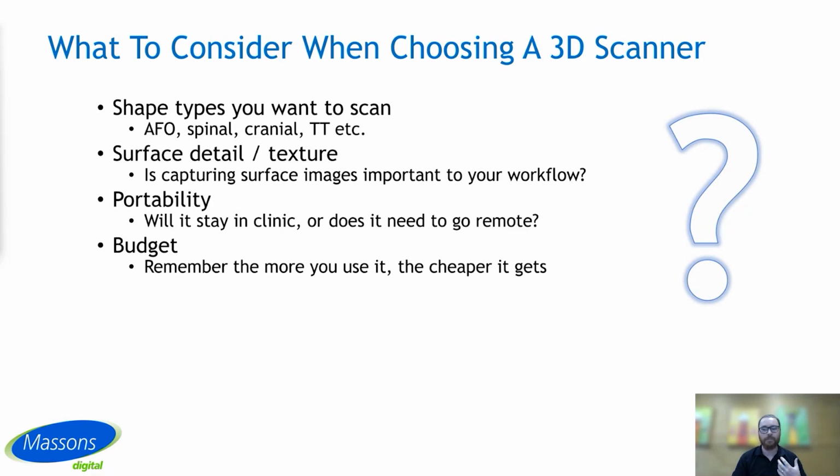So budget really does determine how much you can spend on the scanner, but it's important to remember that the more you use a piece of equipment, the cheaper it gets over time. If you end up transitioning to quite a fast digital workflow, you can pay off scanners quite quickly. But if you're maybe looking to dabble into it and dip your toes in before really committing to something with a fair cost, maybe something a bit cheaper will get you in.